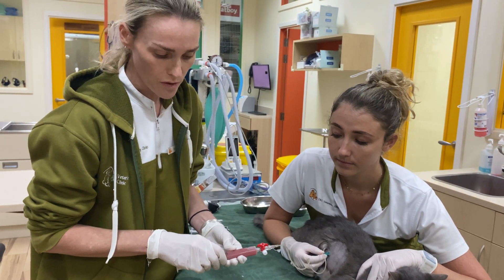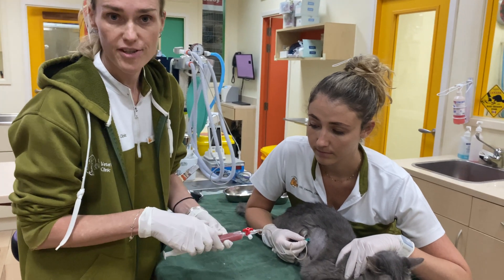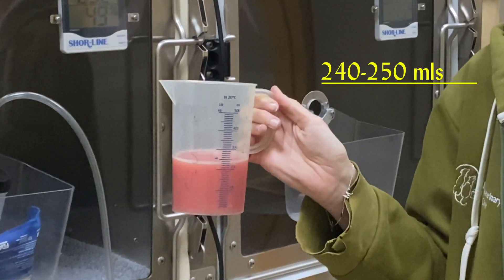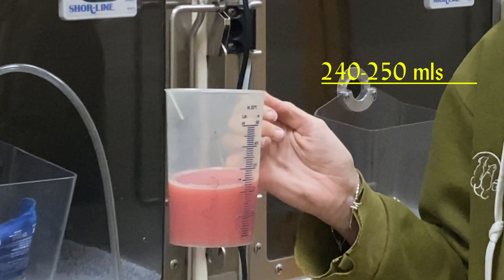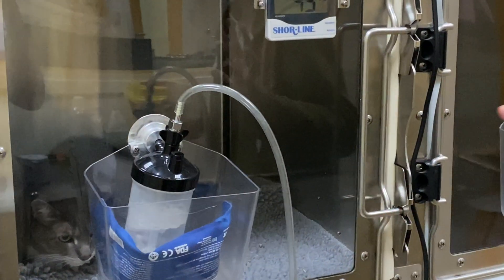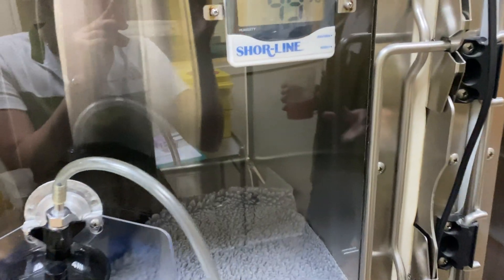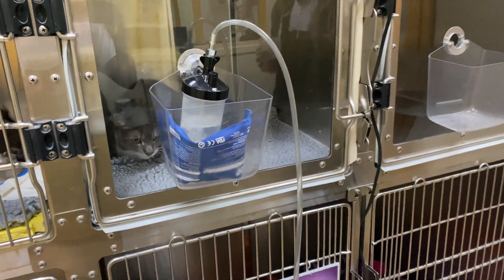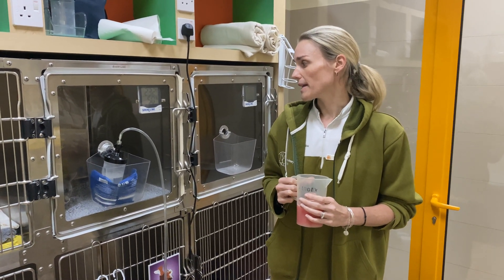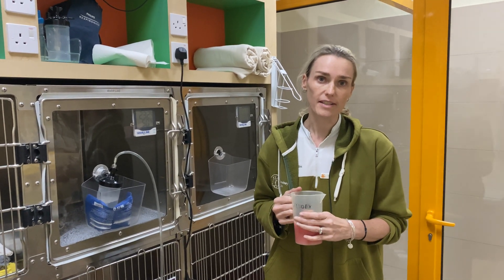We'll continue to drain both sides of his chest. This is what we drained from Puma — around almost 250 mils of liquid from both sides of the chest. He is now back on oxygen and his breathing is definitely a little less labored from his tummy area, so he's going to start to feel a lot more comfortable again. We need to unfortunately continue this way with him until we find that he's either settling down by himself, or he just continues this way.